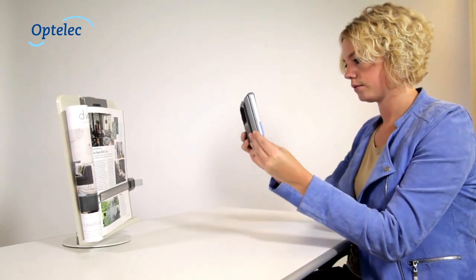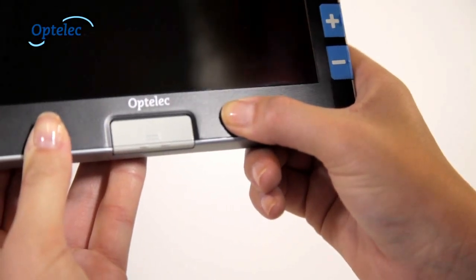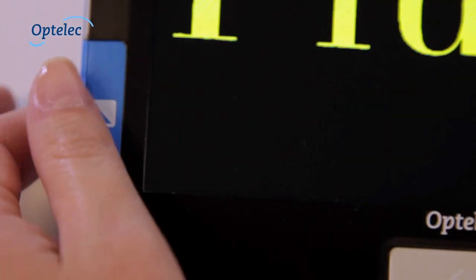The Compact 7 HD can also be used in the closed position. Turn the Compact 7 HD on by pressing the on-off button. You can then select the magnification and color settings.